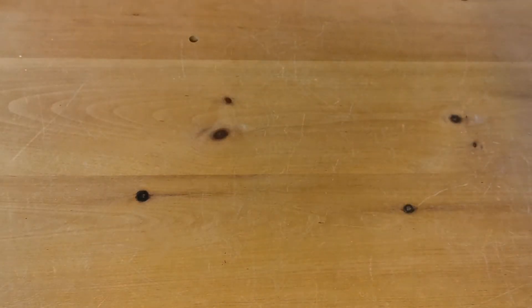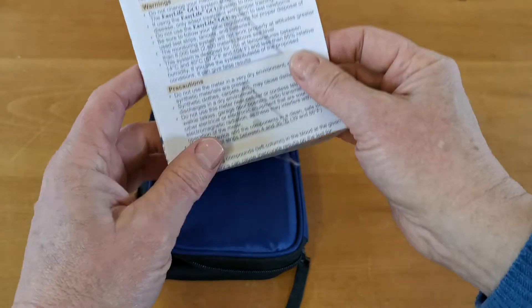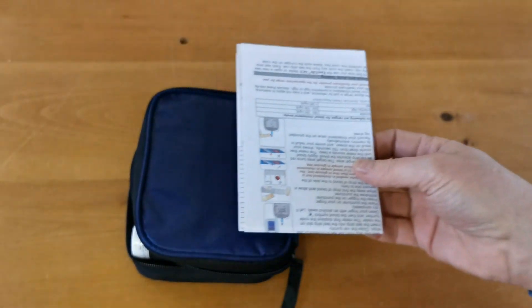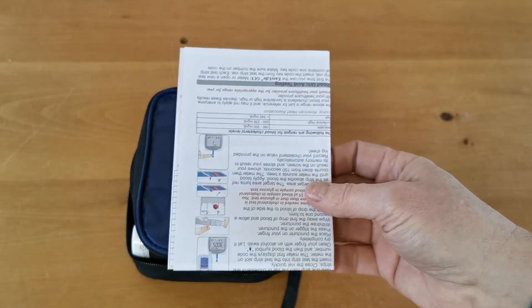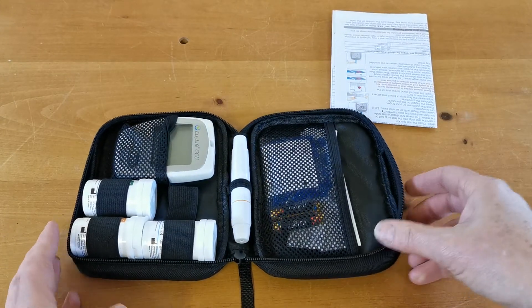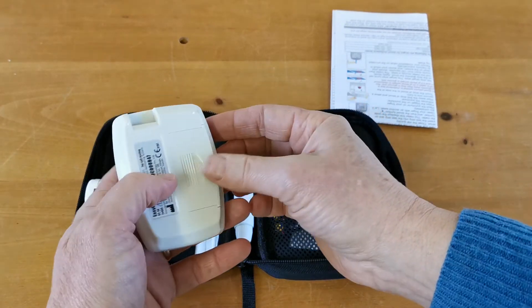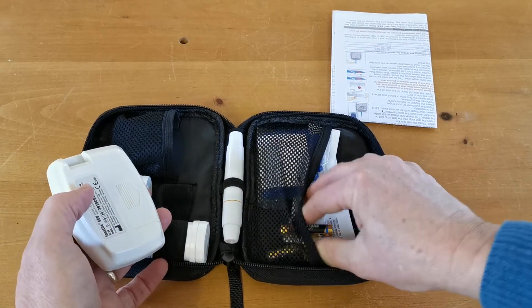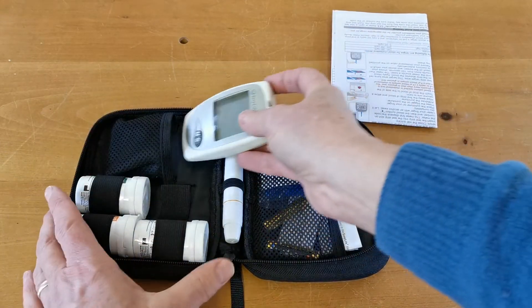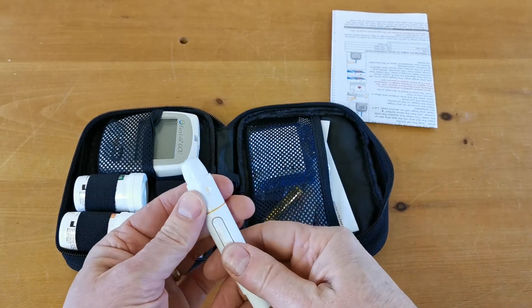Now we'll show you the full contents of the packet. The user manual is a quite extensive unfolding guide covering all three types of test strips. There is also a zip storage pouch. The first main item to look at is the meter itself, which should say GCU on the front. It doesn't come with batteries pre-installed — those are provided separately and we'll run through installing them shortly.